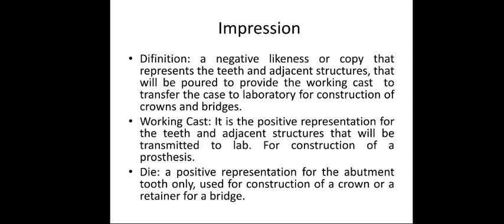The working cast is when we pour the negative likeness, which is the impression. The working cast will be produced, and it is a positive representation of the teeth and adjacent structures that will be transmitted for lab for construction of the prosthesis.